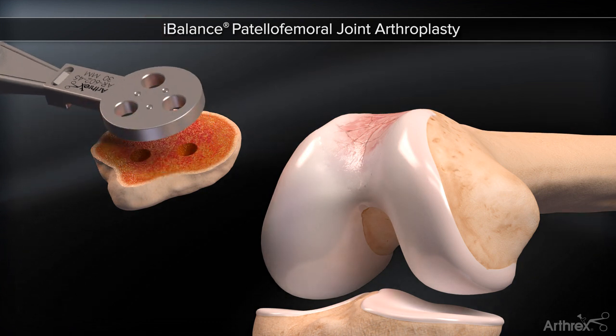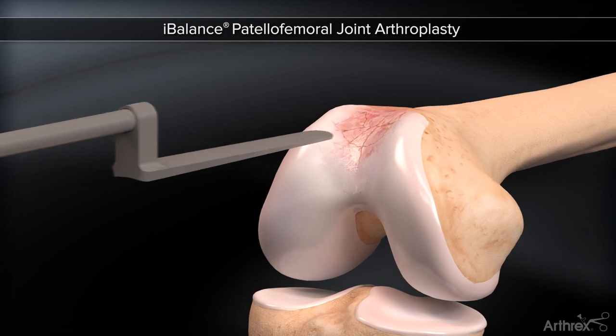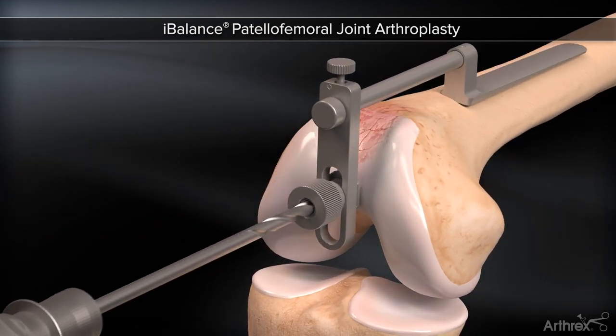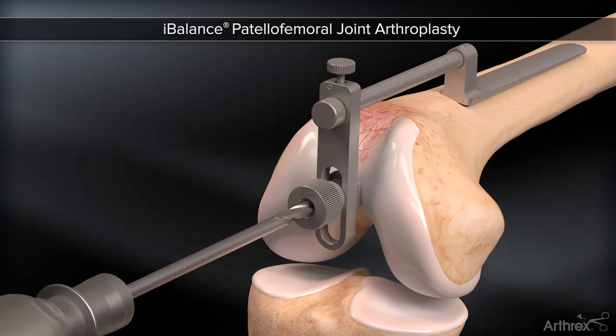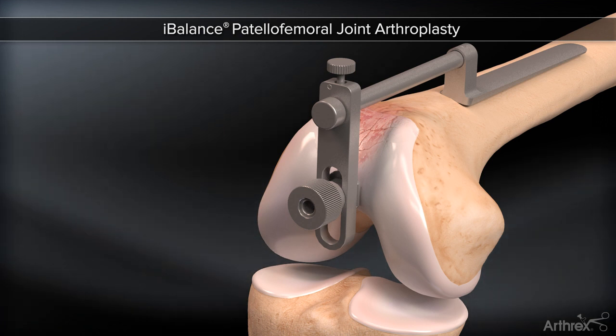Soft tissues are elevated slightly using the blunt end of an extramedullary guide as it is inserted, ensuring it rests on the anterior surface. A 5mm intramedullary hole is drilled, matching native flexion. The entry point should be at least 20mm posterior to the deepest aspect of the trochlea.